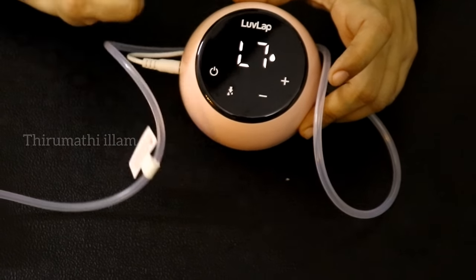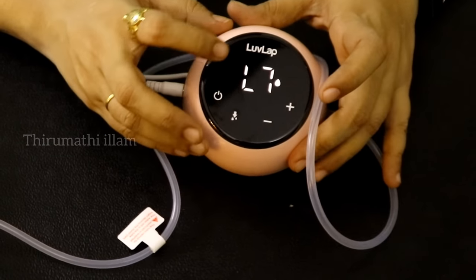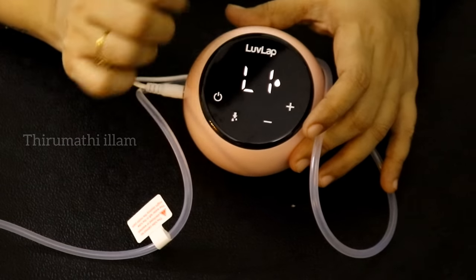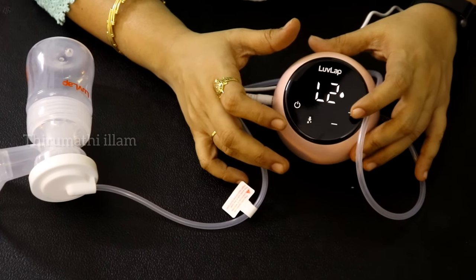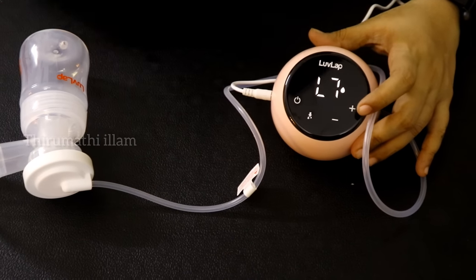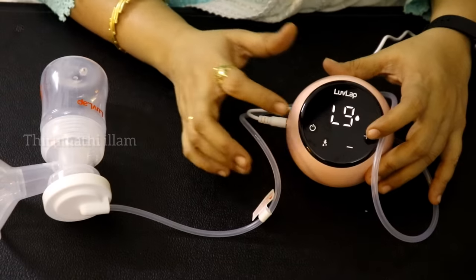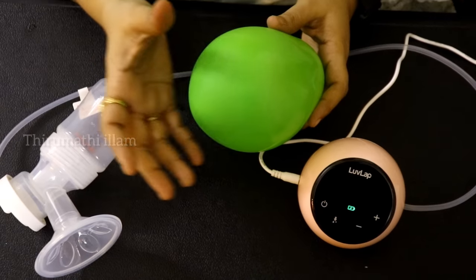You can extract milk using this option. You can use the water symbol for level control. The level is at L7; we can go up to L9. If you increase the suction power, you can start from L1 and keep increasing. You can adjust to the maximum level with the suction power. Now we have a demo — we have the breast shield here. This is how we extract and stimulate.